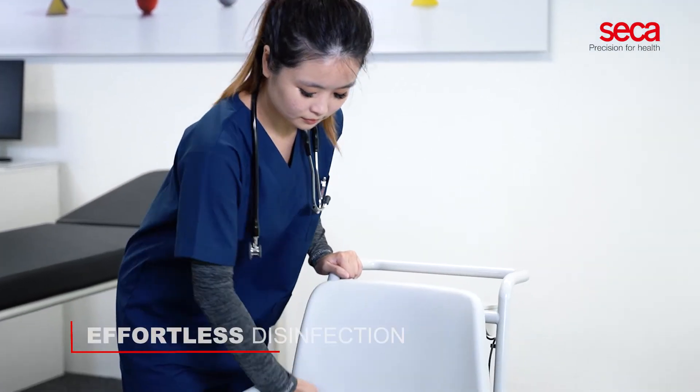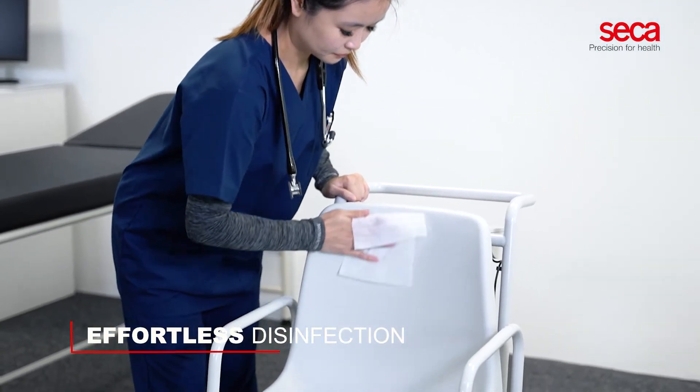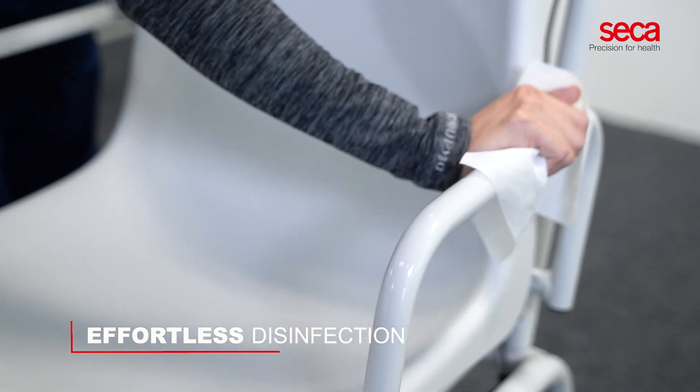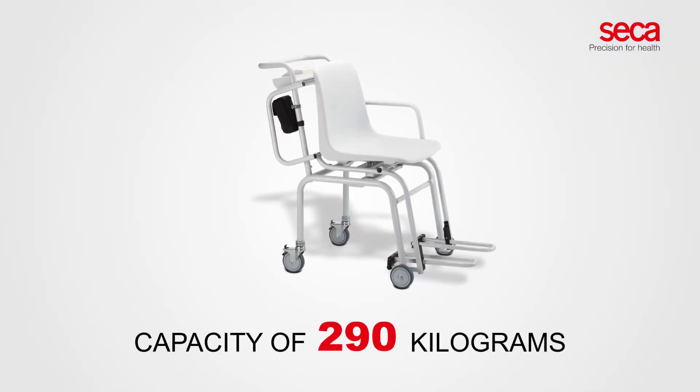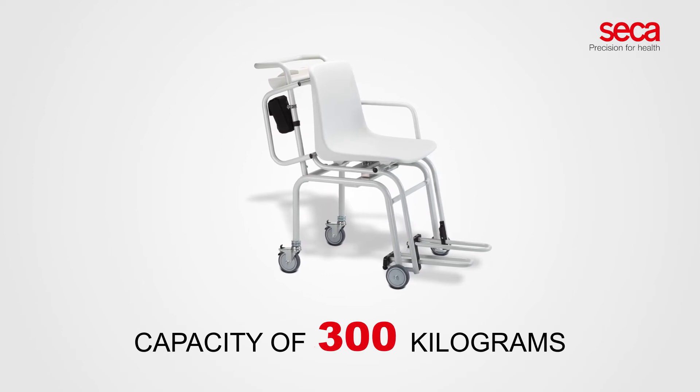The seamless plastic chair and the powder-coated tube frame ensure effortless disinfection. The Sika 954 Medical Chair Scale has a capacity of 300 kilograms.